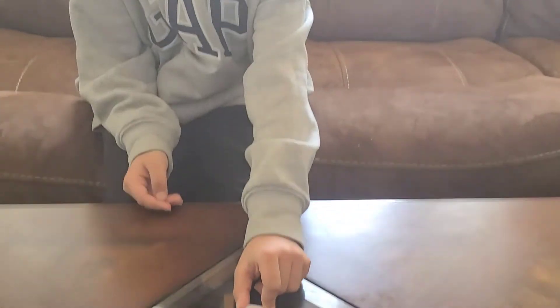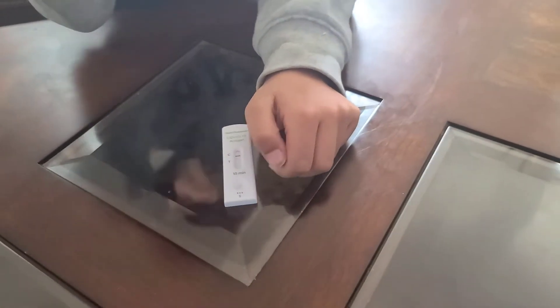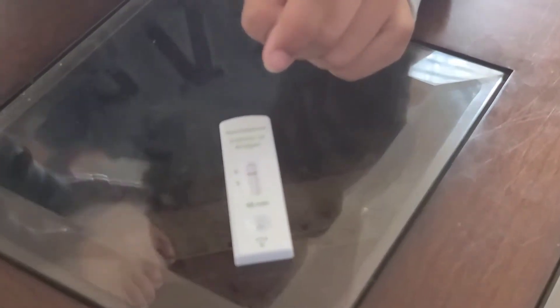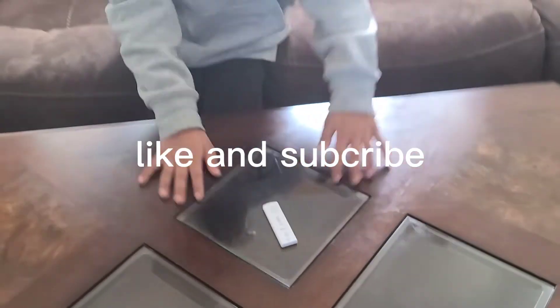Three, two, one, go. I got a negative! If you're going to see right here — if I get one line, it's negative. If I get two lines, that's positive. Positive means you have corona.